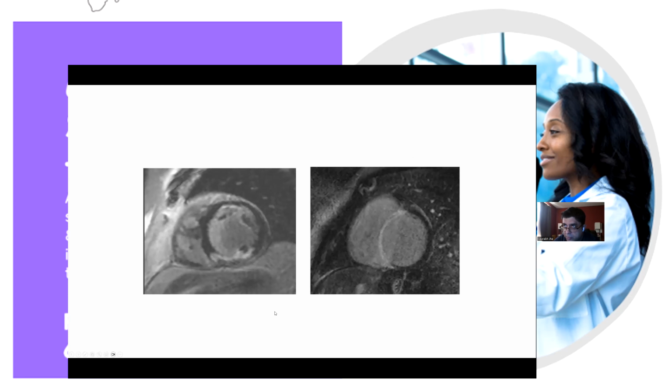So why is that important? It's important because this is all normal myocardium and this is diseased myocardium. You could ask, why didn't we suppress the diseased myocardium and let the normal myocardium be bright? It's easier to see pathology if it's bright because it's more visually congruent than if it was the other way around. So this person has an infarct, the whole septum of the myocardium, the whole thickness of it is dead. It's fibrous tissue, it's no myocardium.